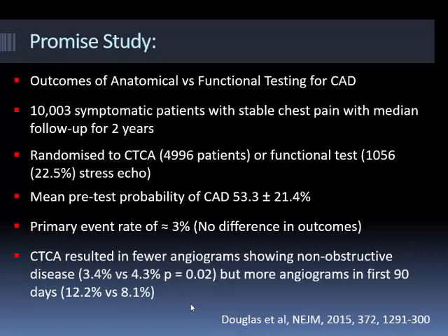Where we found great help is in patients, for example, with left bundle branch block, where you know the stress echo is going to be challenging. You think actually the coronary arteries are going to have no significant stenosis, at least from the history, and you just want that added reassurance, and CT angiography performs very well. And in chest pain clinic patients coming through with an equivocal exercise test, where you want to discharge the patient but can't with an equivocal test, you can use CT angiography.